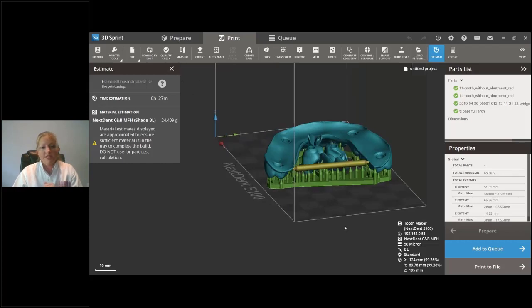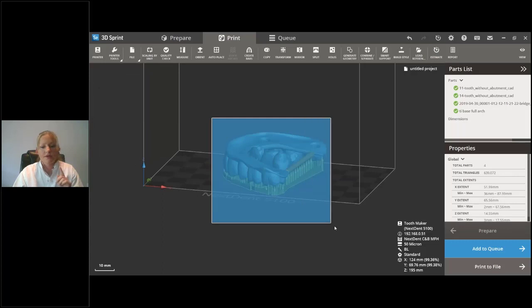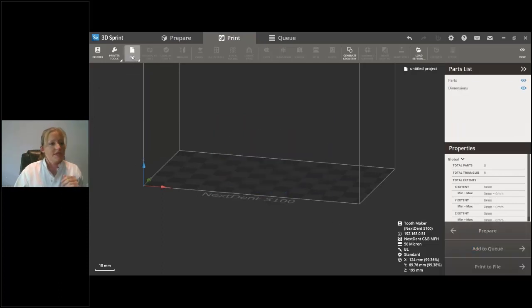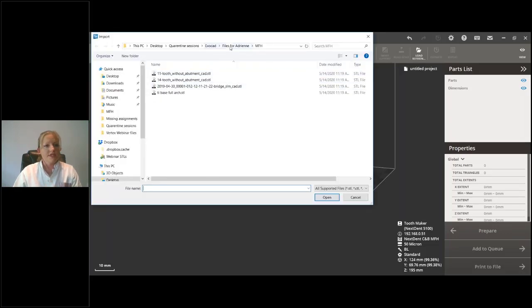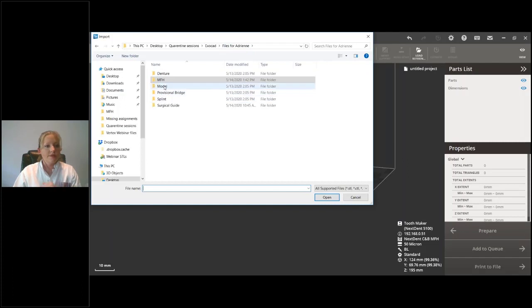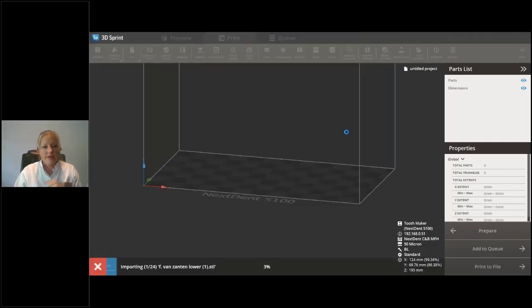So I'm going to go back to my presentation now, but this is a good idea of how the nesting, actually, I'm not. I'm going to show you stacking real quick. So if you're an orthodontist, or if you're somebody else who wants to make aligners in-house, or any other type of orthodontic models, and you want to do a lot of them, I think this is a really cool new perk that we just released yesterday to everyone.